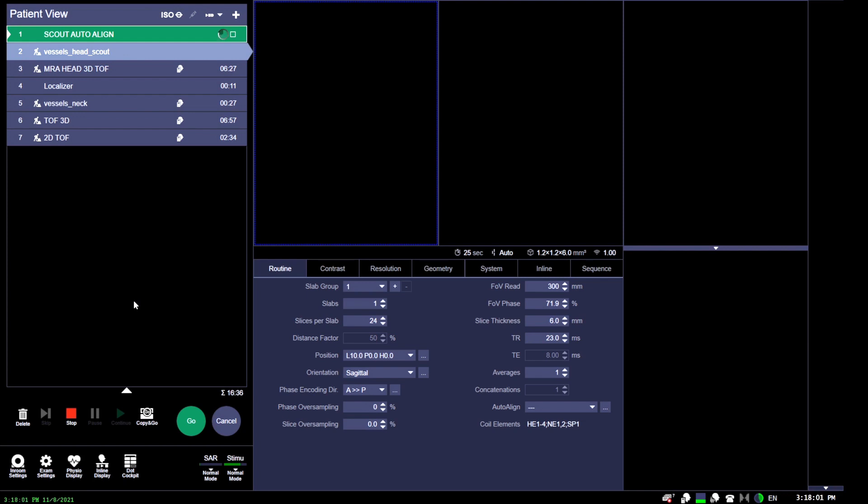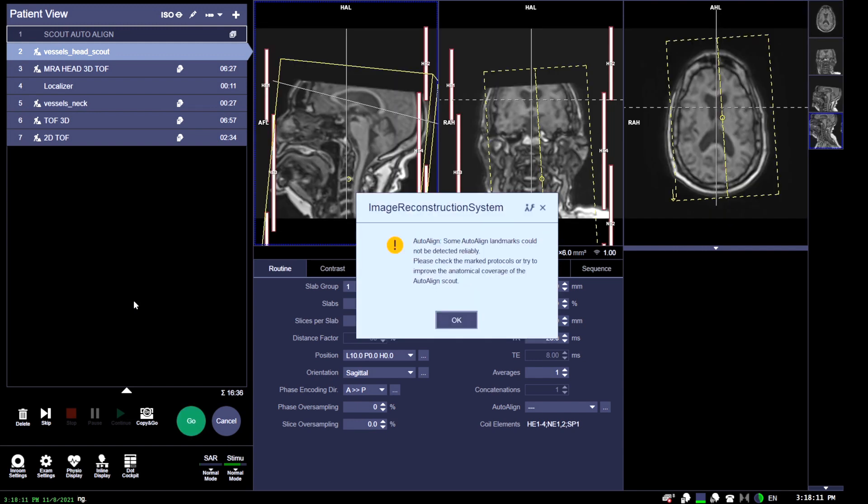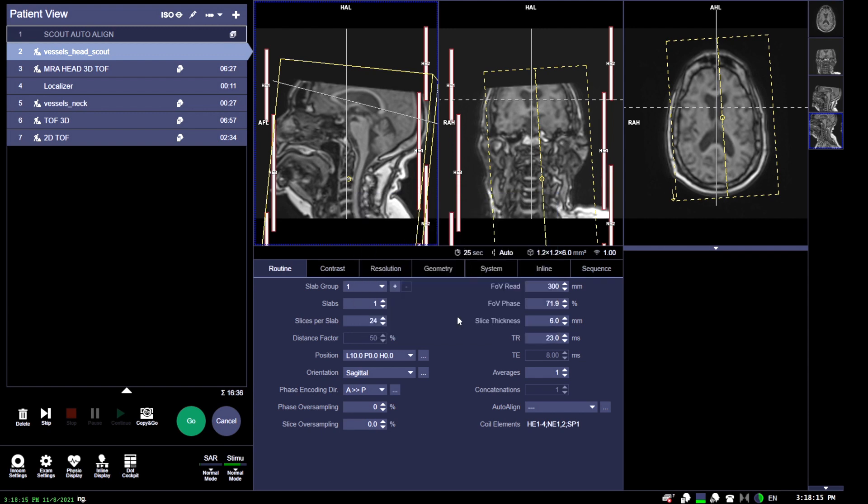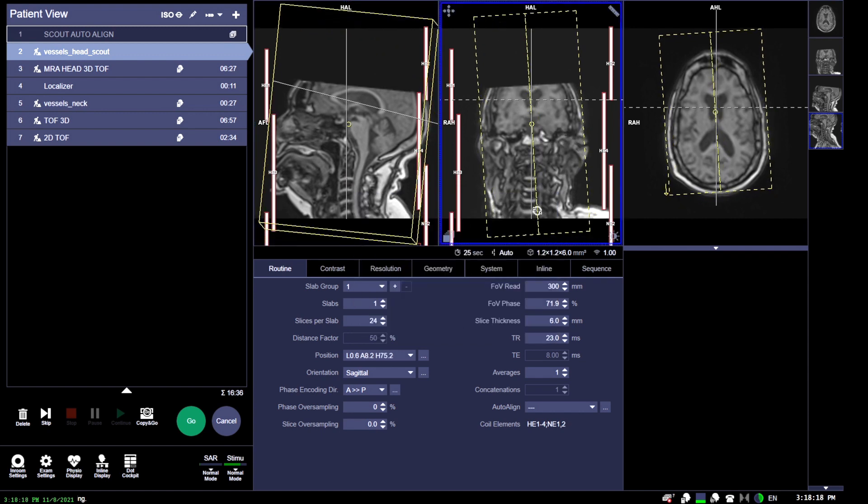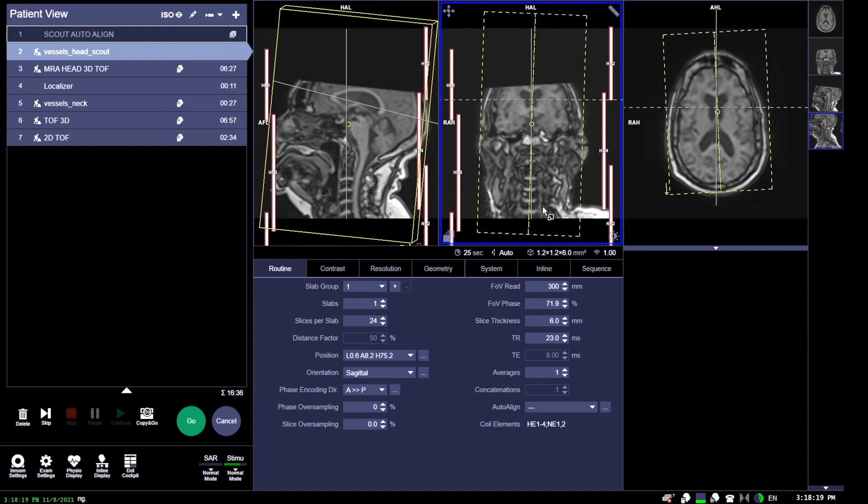We have our localizer running now, which will be coming out any second. Essentially what you're going to be doing here is covering the arterial flow of the brain—all the oxygenated blood coming from the heart to the brain. You want to run your slices perpendicular to the flow.